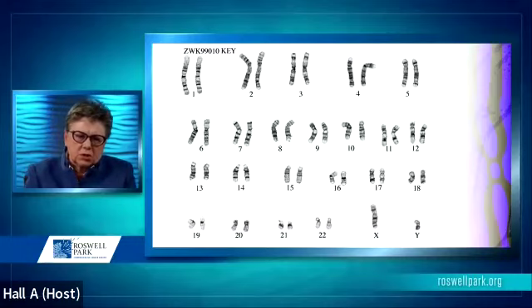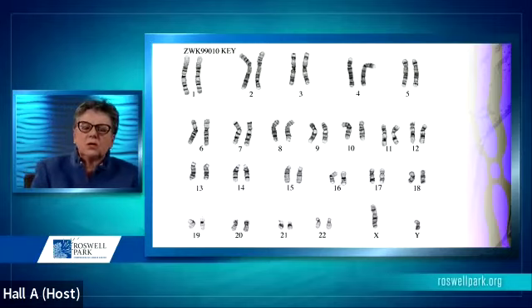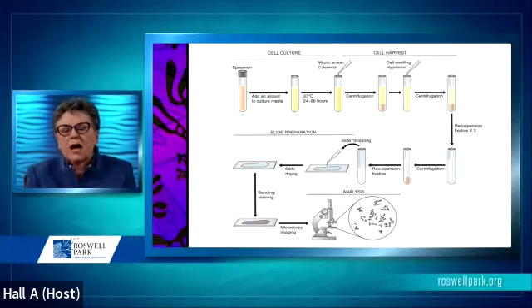The organization of the chromosomes is pretty much standardized, and an experienced technologist is used to identify the chromosomes. This requires a lot of training in a laboratory, about 2 years, in order to identify all the chromosome changes associated with cancer. So how is this analysis performed?